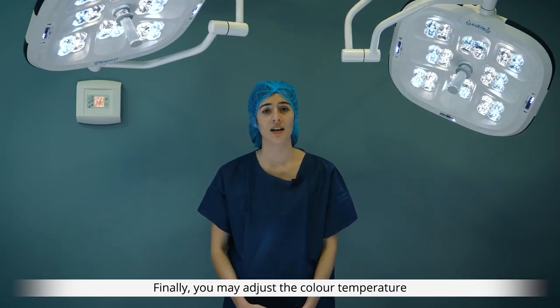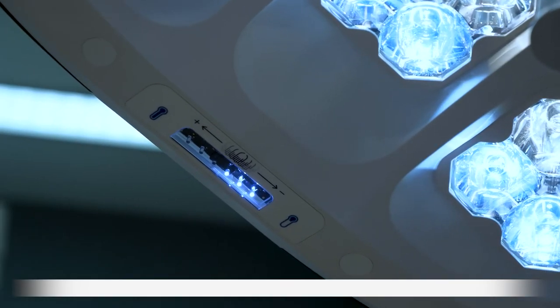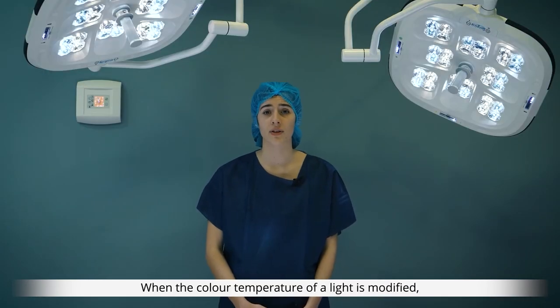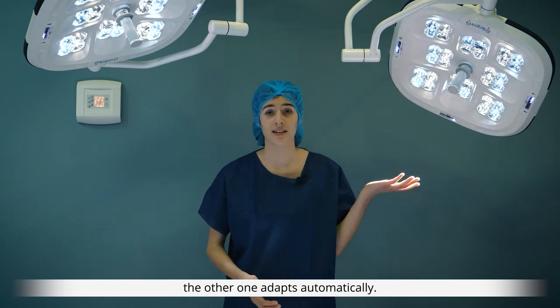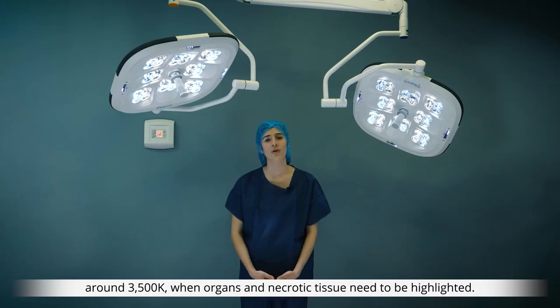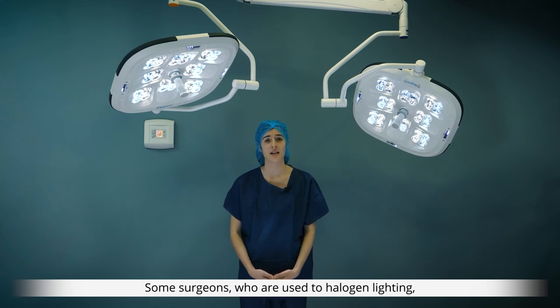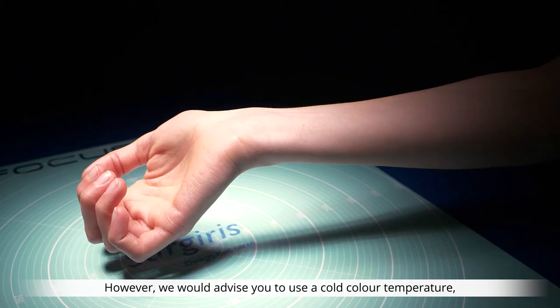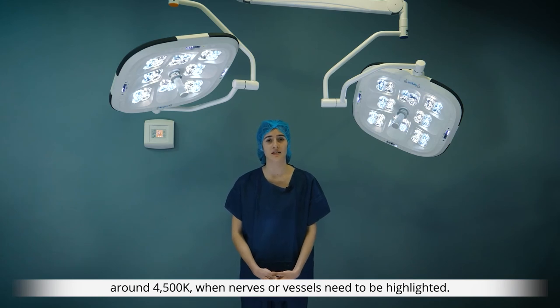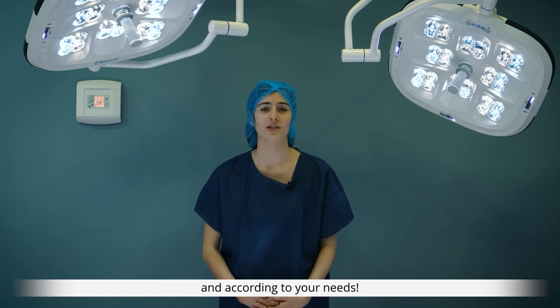Finally, you may adjust the color temperature using the sensor symbolized by a blue thermometer. This color temperature may be adjusted from 3500 to 4500 Kelvin and is synchronized between the two lights — when the color temperature of one light is modified, the other adapts automatically. We advise selecting a warm color temperature around 3500 Kelvin when organs and necrotic tissue need to be highlighted, as surgeons accustomed to halogen lighting may also prefer warm tones providing red-orange shades. Use a cold color temperature around 4500 Kelvin when nerves or vessels need to be highlighted, and don't hesitate to modify this setting during a procedure according to your needs.